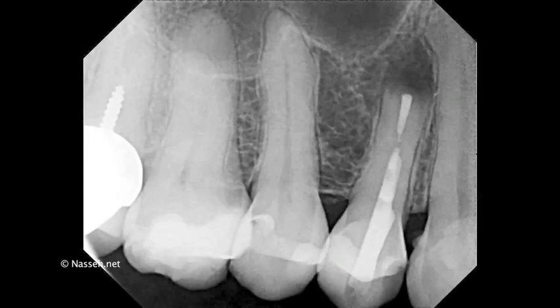Hello and welcome to another microsurgical endotutorial. My name is Dr. Alan Nassim. In the previous tutorial, I demonstrated the use of a technique I've developed with the injection of the bioceramic root repair material followed by the placement of a cone of a bioceramic putty into it.